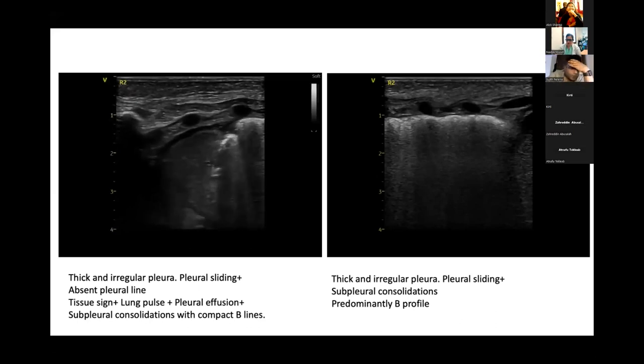Yeah. Very strange, because in chronic lung disease you do have changes like this, but you're positioning the baby, suctioning the baby, ventilating the baby, changing management strategies. So these change. When you flip the baby over, it opens up on one side and closes on the other one. The exact same place is really suspicious, though. So this was not related to the possible pneumonia. This was something this baby had before, during... Yes, that is right. This is something.